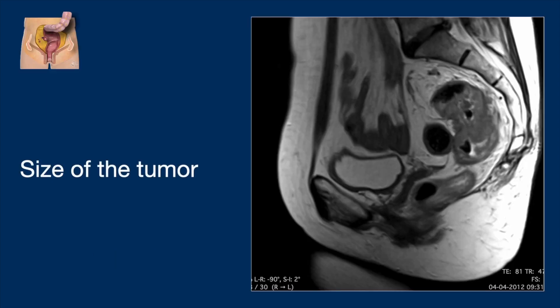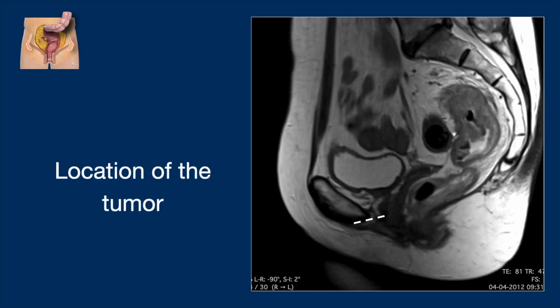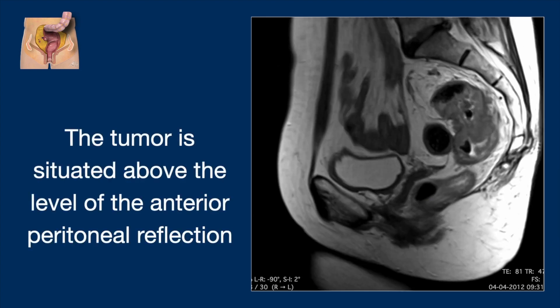What's the size of the tumor? It's about 44 millimeters. The location can be measured from the anorectal junction up, and it's about 8 centimeters. This tumor is situated above the level of the anterior peritoneal reflection, which is an important landmark. Here we have the peritoneum and this is the point of the anterior peritoneal reflection. Tumors above this level may infiltrate the peritoneum.